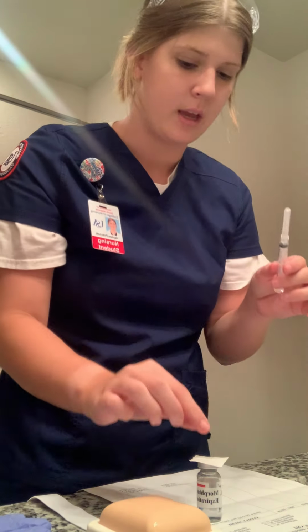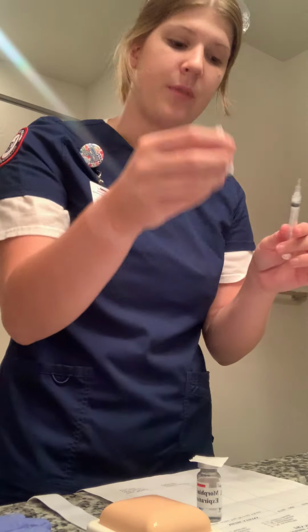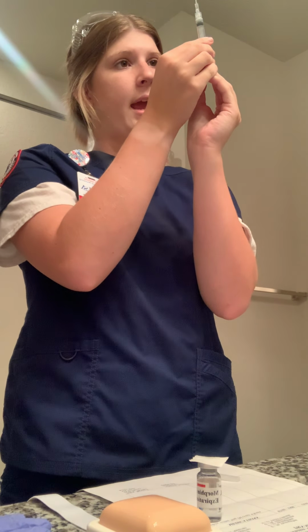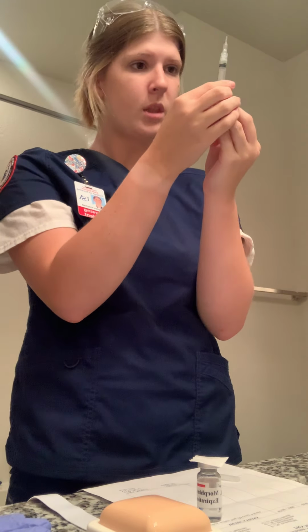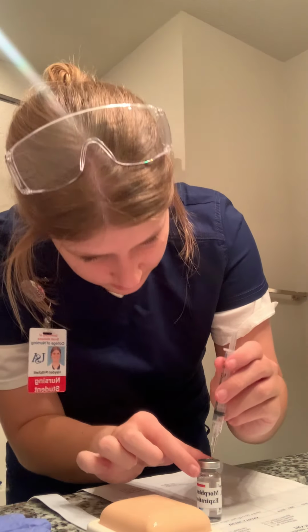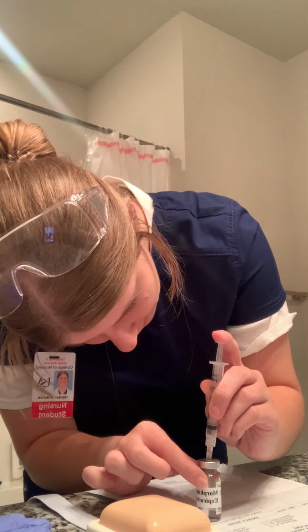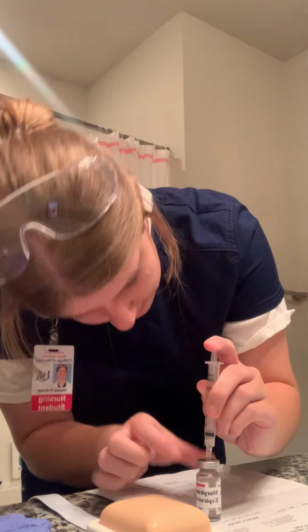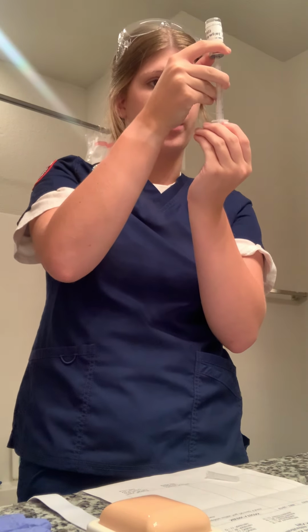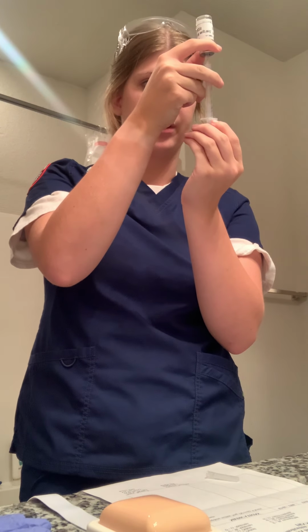So now that I have this, first I'm going to aspirate for 1/2 milliliter, so that it is the same amount of the dose. And I'm going to take this off. I'm going to stick it in there. I'm going to aspirate. Okay. And now I'm going to flip it over, and I'm going to pull it to 1/2 milliliter, which is equal to 5 milligrams.